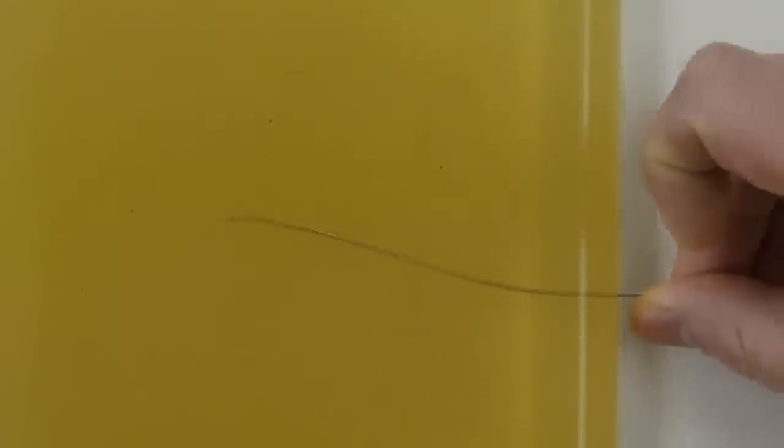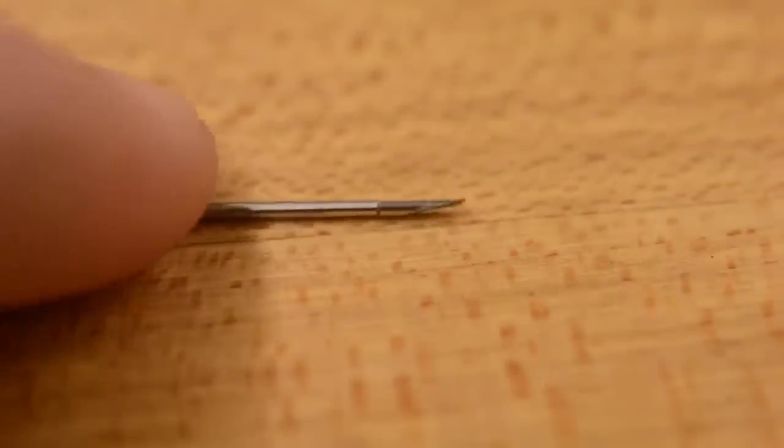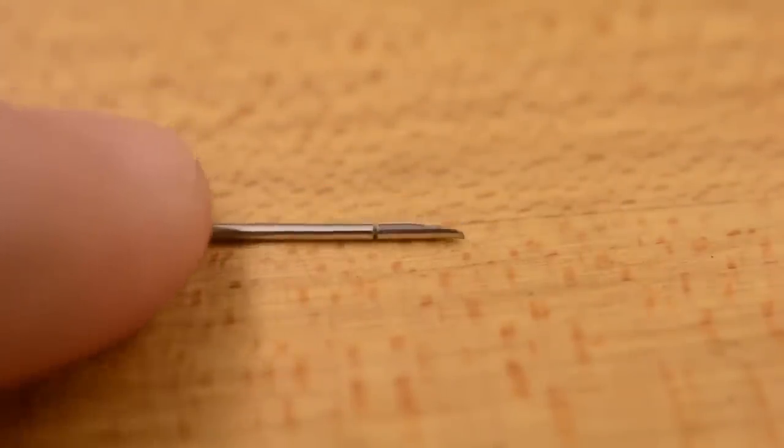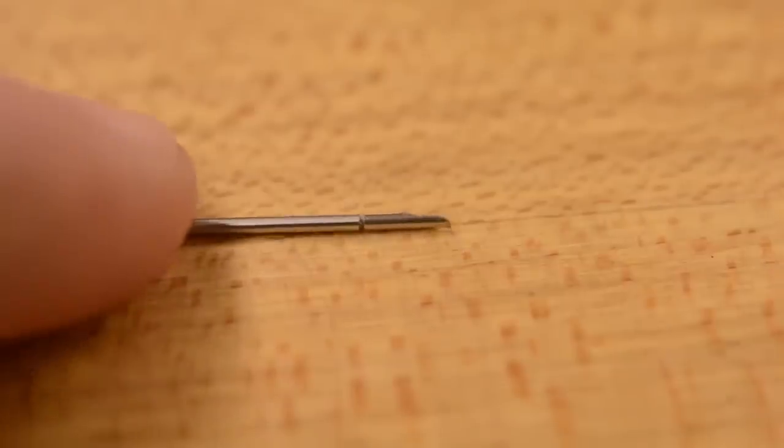Steerable needles are a promising method for drug delivery and biopsy that can avoid critical and delicate structures along the needle path while enabling higher tip accuracy. Most steerable needles employ an asymmetric bevel tip, seen here, that causes the tissue to apply a force at the needle tip. This force causes the needle shaft to bend in a circular arc.